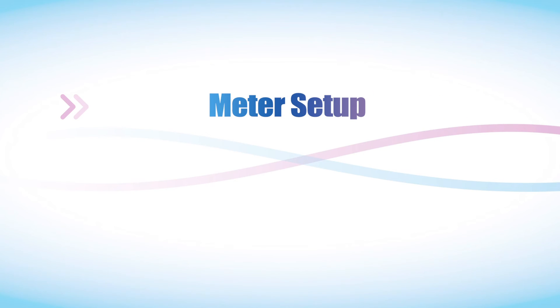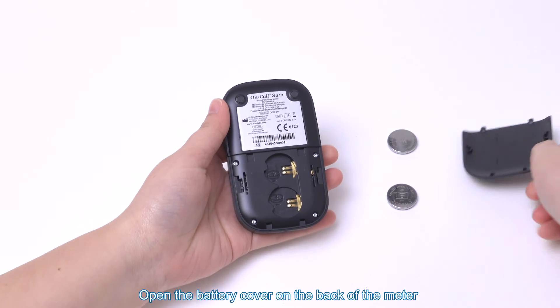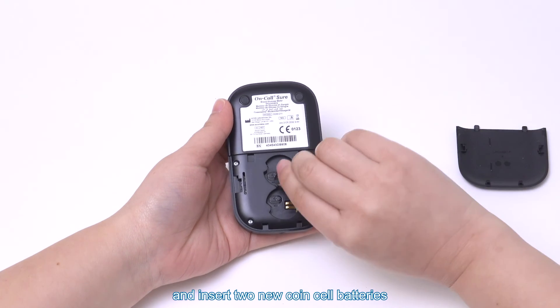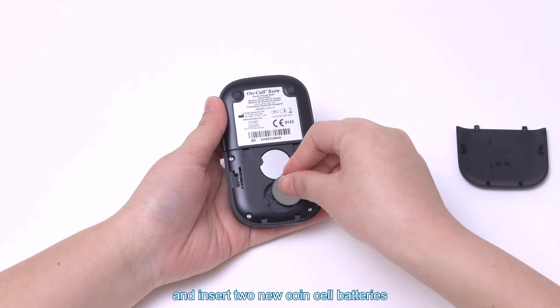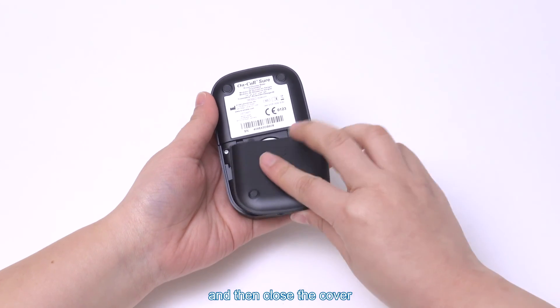Meter setup. Installing the battery: open the battery cover on the back of the meter and insert two new coin cell batteries. Make sure they are placed with the plus side facing you, and then close the cover.